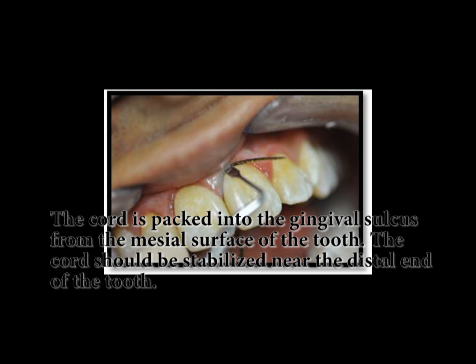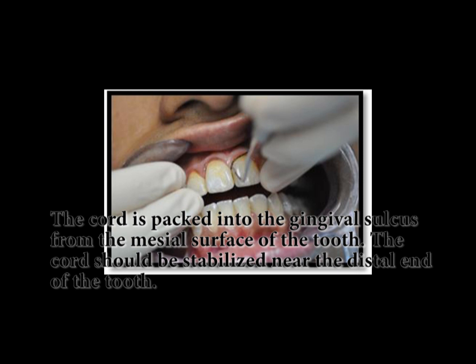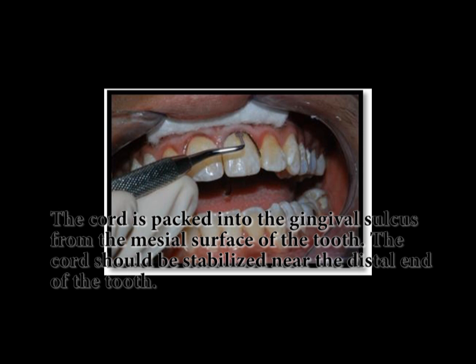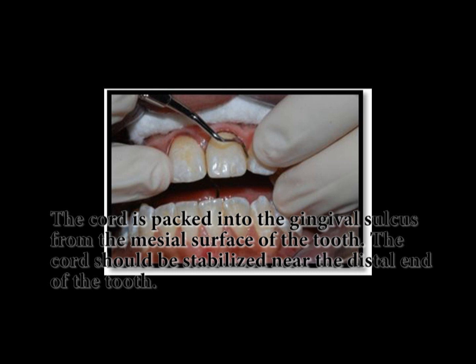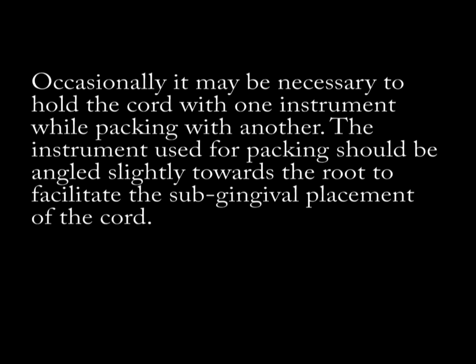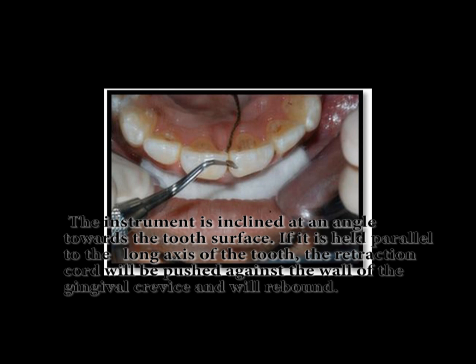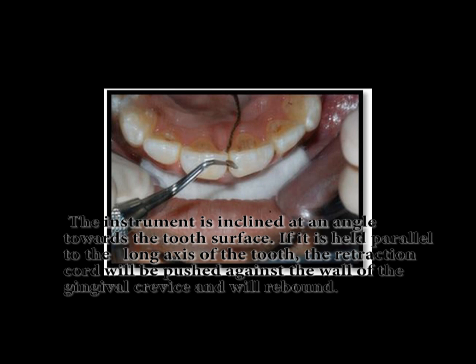The cord is packed into the gingival sulcus from the mesial surface of the tooth. The cord should be stabilized near the distal end of the tooth. Occasionally it may be necessary to hold the cord with one instrument while packing with another. The instrument used for packing should be angled slightly towards the root to facilitate subgingival placement. The instrument is inclined at an angle towards the tooth surface. If held parallel to the long axis of the tooth, the retraction cord will be pushed against the wall of the gingival crevice and will rebound.